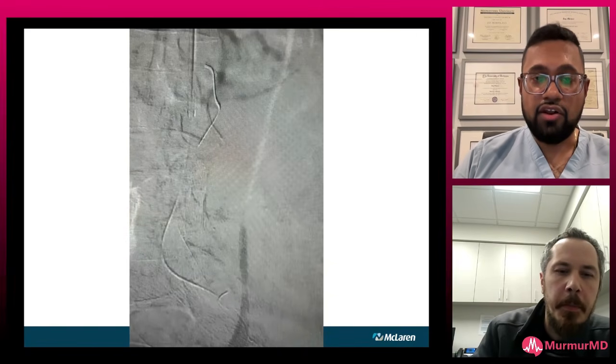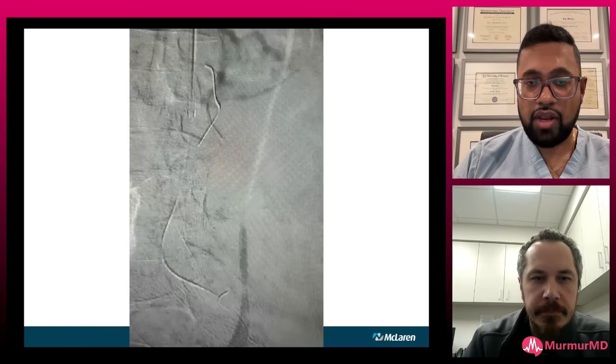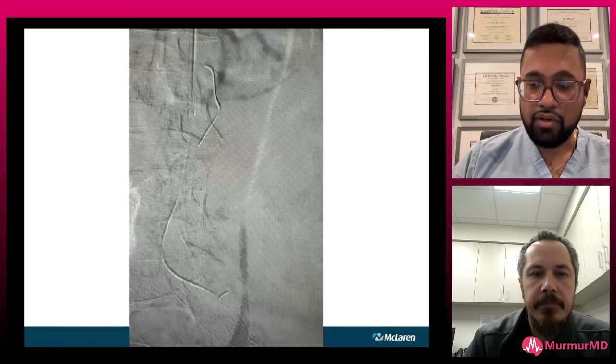Yeah, exactly. And also, sometimes the wire itself is tamponading wherever it's at. So I always, in my mind, think it's controlled. It's stable. It's not causing any problems at this point. So I was just very reluctant to pull it. And then once I feel comfortable that I'm going to be able to get a covered stent into whatever segment I'm going to, then I feel comfortable pulling it at that point.